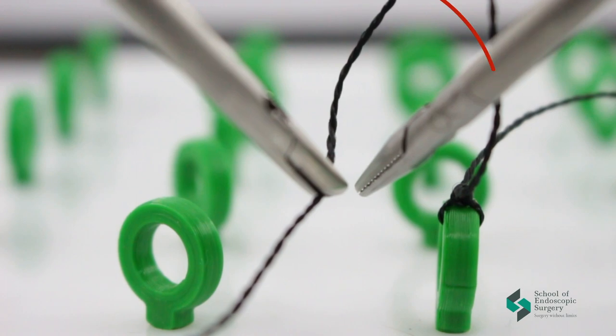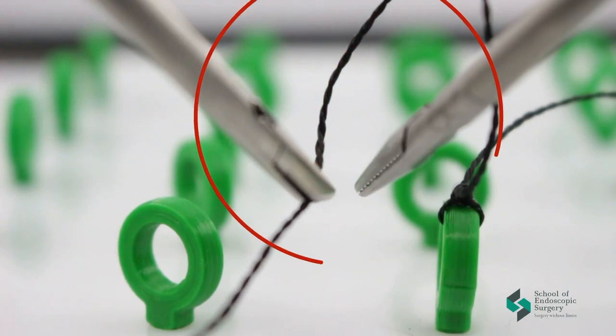One important rule is that the thread must be parallel to the instrument with which you form the knot.